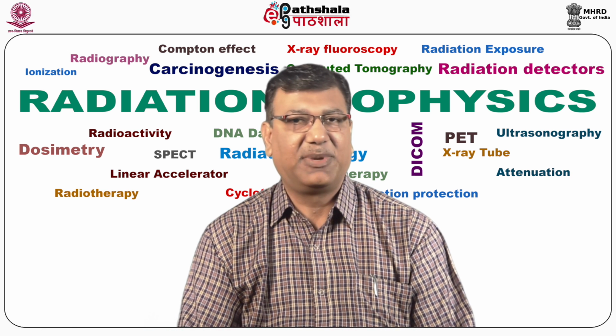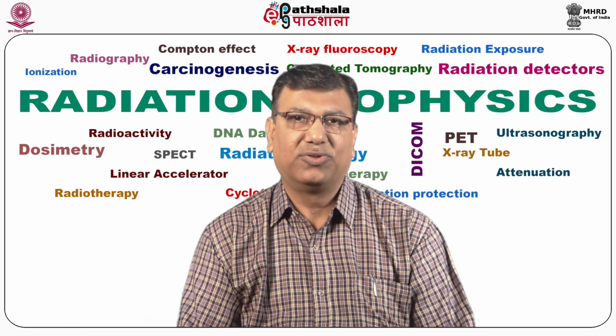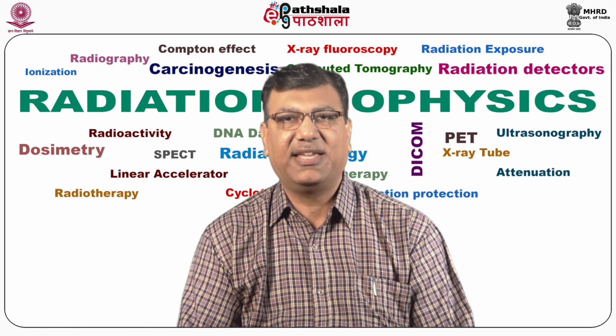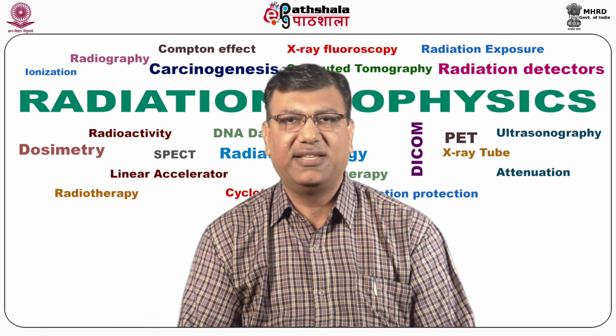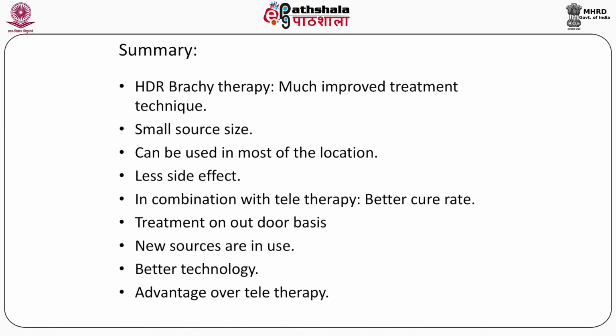But if planning is not proper, it can be the reverse also. There will be more side effects. So one has to be very careful. The physics part is very important in this to plan the case. In combination with teletherapy, it has been observed that a better cure rate can be achieved by using teletherapy and brachytherapy.